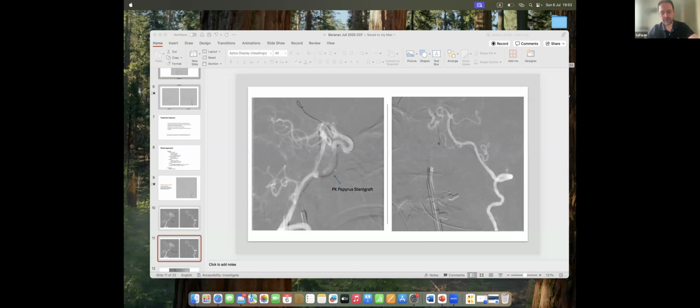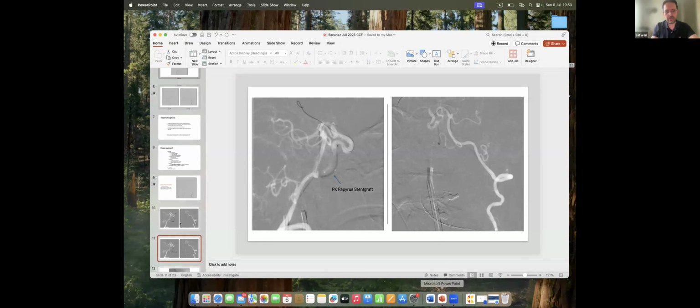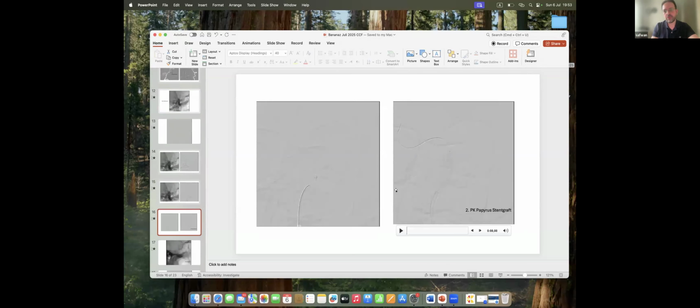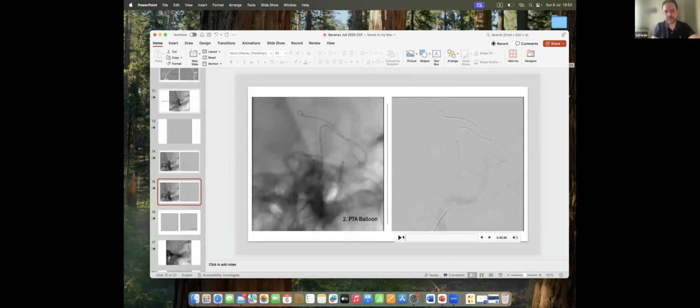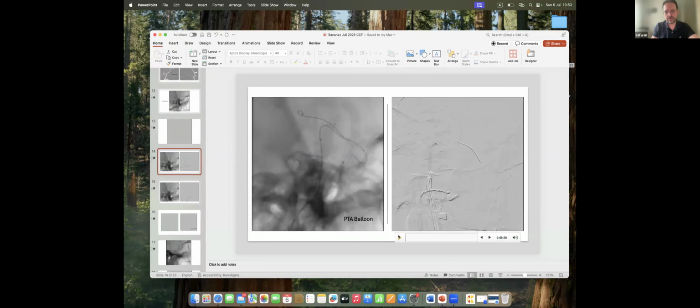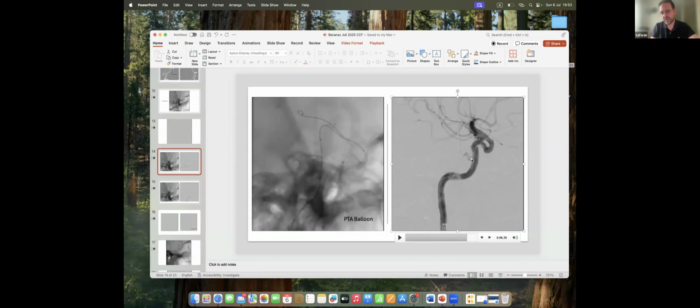I just want to come back to the other question about how the stent went down with the balloon. If I show again quickly, when I dilated for the second time, maybe I could have just left it there and coiled the sinus for this small remainder that was still there. I didn't.